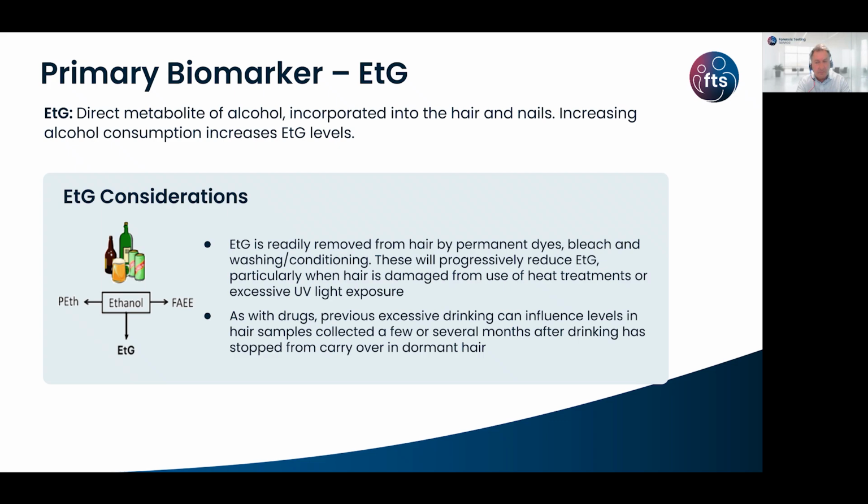So if you're working with a laboratory, it's important that the laboratory understands the background of the client. So if you instruct FTS, as I've said, we do a full 40-minute interview of the client and we ask specifically all these questions related to what they do to the hair. So we ask everything about which shampoo they use, how often they use it, what shampoo brand, how much time do they spend in the sun, do they use sunbeds, do they use hair treatments, do they use hair straighteners.